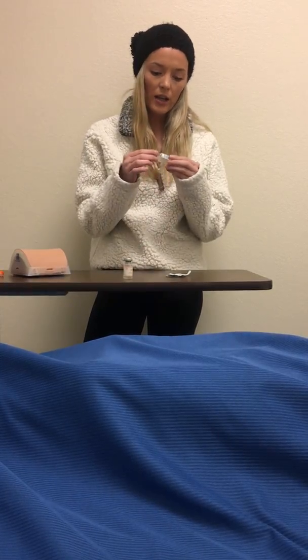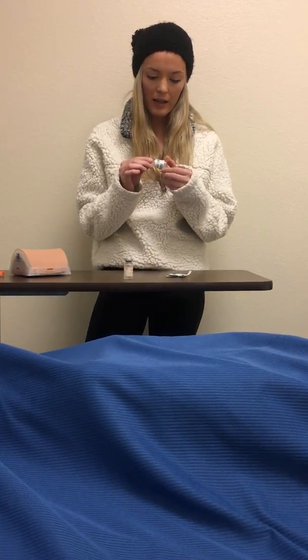you're needing to give. I'm going to check the MAR 3 different times during this process: when I'm getting the vial out of storage, when I'm preparing the insulin, and before I put it back in storage. I'm also going to check the expiration dates on the insulin, and then I'm going to take it into the patient's room. I'm going to explain that he's getting an insulin injection for his glucose, check his allergies, and wash my hands. Now I'm going to prepare the insulin.